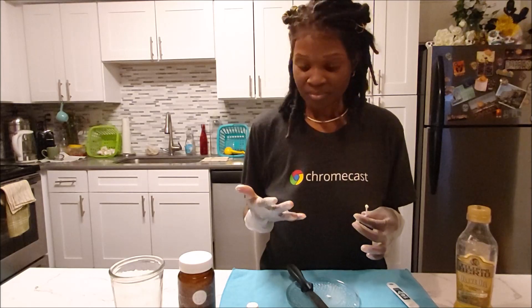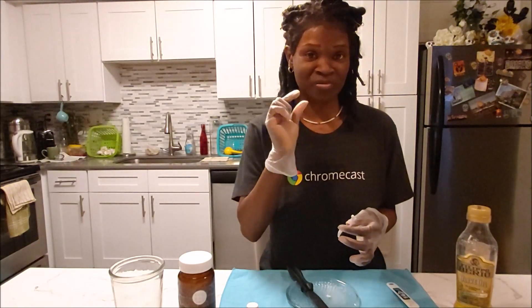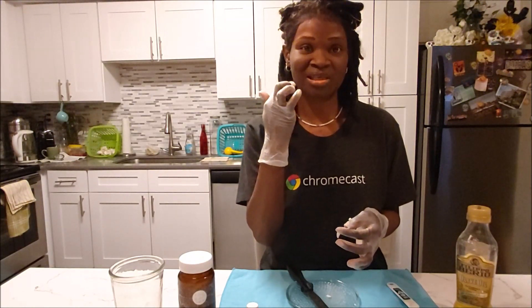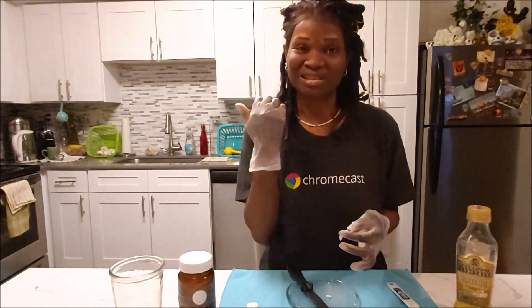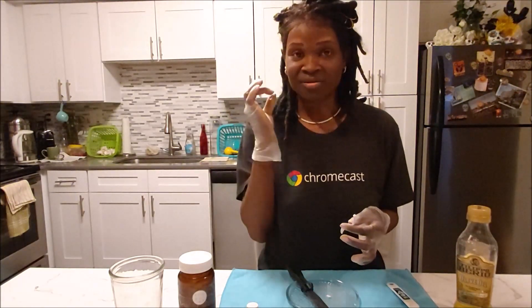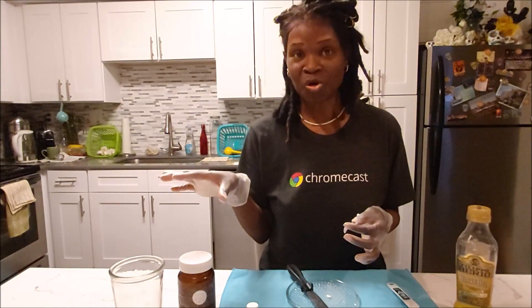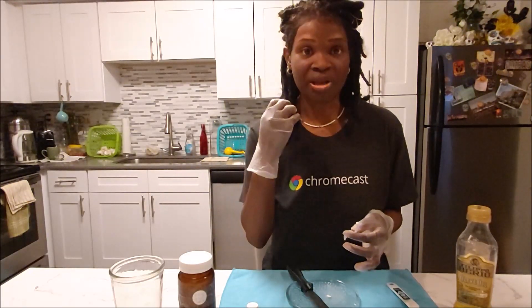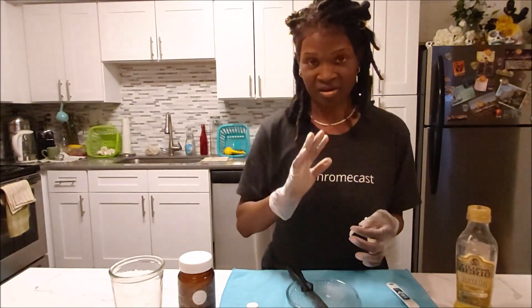Oh, and I forgot — I use a little piece of saran wrap. I put it in between the top and bottom of my teeth and I bite it down. And I take some water — I bite down and get it all packed in more with my teeth. Then I take the saran wrap out of my mouth. And then that's where the cold water comes into play, because the cold water helps it to start getting hard in your mouth. So you take the cold water, swish it around, and then you're done.